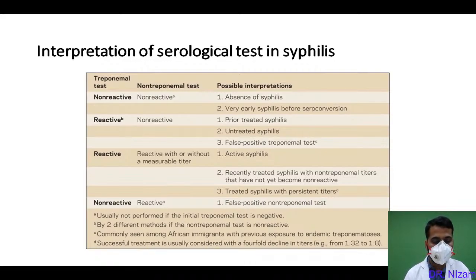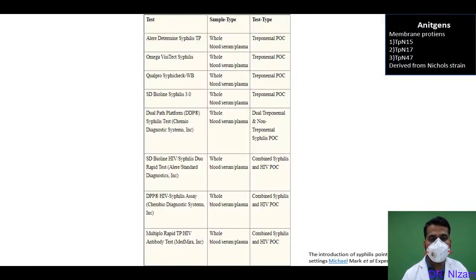Dr. Minta wants you to expand on POCT, the basis being agglutination test. Are there any FDA approved agglutination tests? No, the rapid POCs which are FDA approved are only based on the immunochromatographic test, but not on the agglutination test. And what I have shown are all FDA approved, and there are just 8 FDA approved rapid POC tests, which I have shown in my previous slide. These are the 8 FDA approved till now.